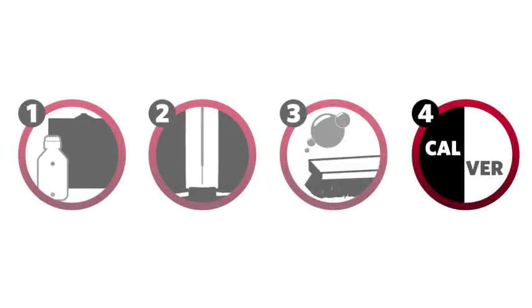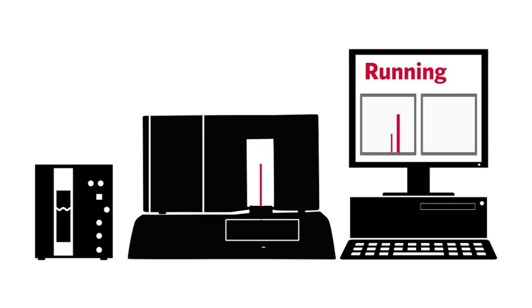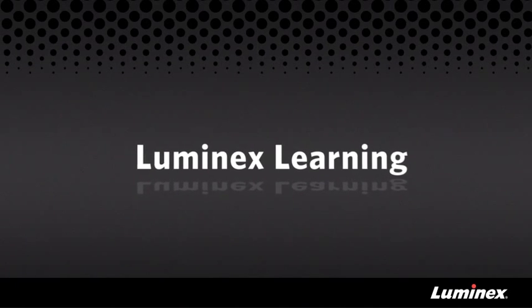That was the last step in the stringent clean. If the calibration and verification completes without any errors, your Luminex 200 instrument is working properly and is ready to start working on your samples and assays. If the stringent clean didn't fix your issue, there is something more complex going on and you should call us at technical support for assistance. You can also check out the resources we have online at www.luminexcorp.com. I'm Linden, and I want to personally thank you for choosing Luminex.